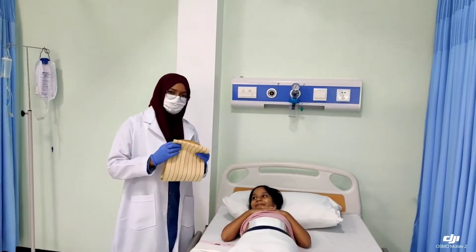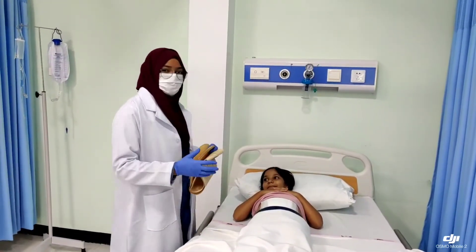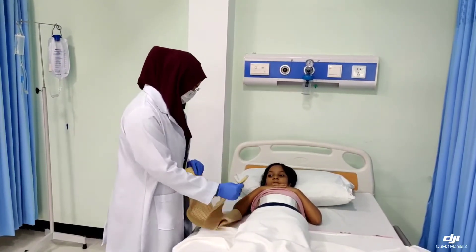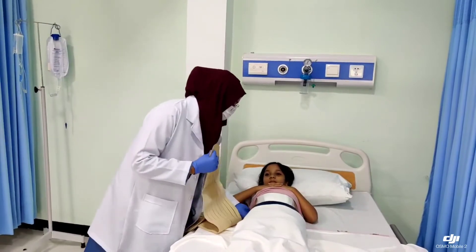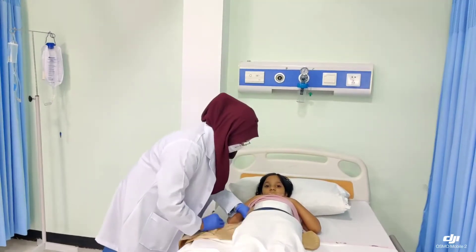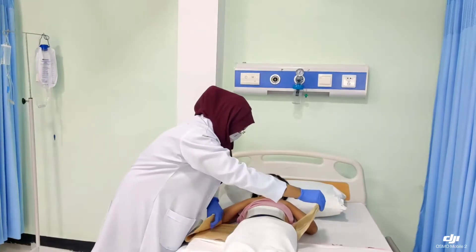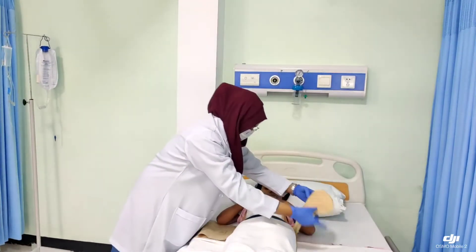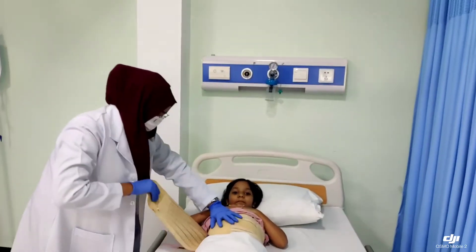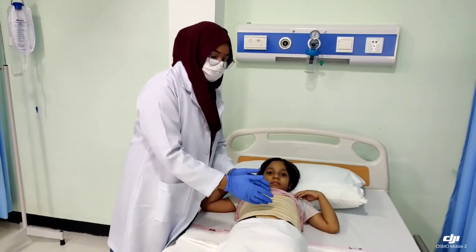So here I have an abdominal binder. It's very simple if the patient is small and you can lift the patient, it will be very easy. We will just lift the patient and place it under — the soft part touching the abdomen. So carefully adjust it.